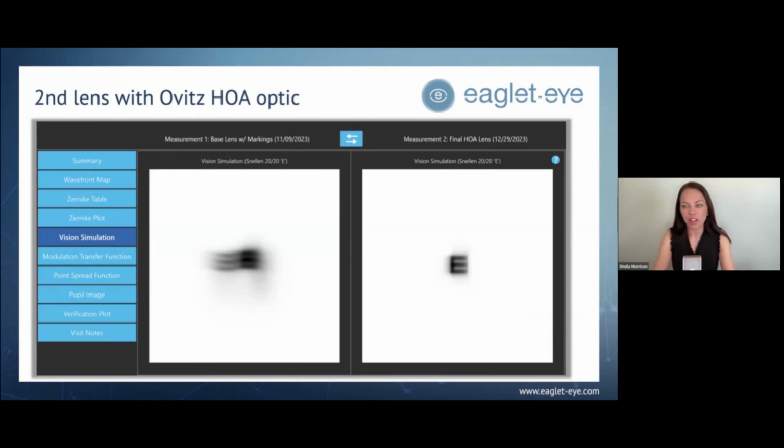Something's really been bothering me for a long time and no one really understands. And in this case, patients who are unhappy sometimes have a hard time explaining to a vision provider, or somebody else, why they're so unhappy. And this is a cool little visual simulation. I mean, patients aren't seeing this blurry with everything, but in some lighting, they do get ghosts that look just like this. And you'd be amazed at their reaction when you show them these sort of simulations of what they may see. They say, yes, that hook, that's what I see.